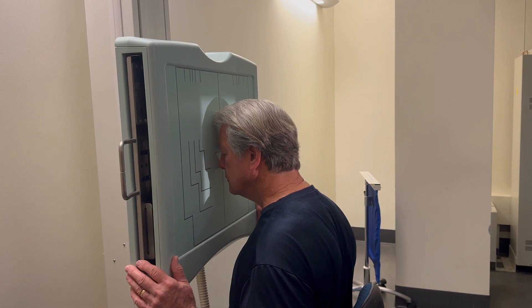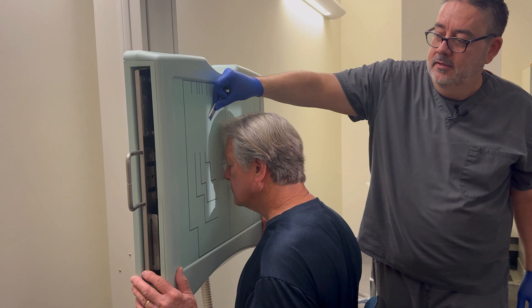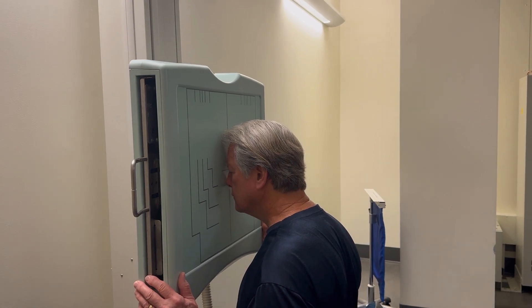Then collimate. I may put my left marker up here. This should be done on suspended respiration, and the patient can relax as soon as the exposure is made.